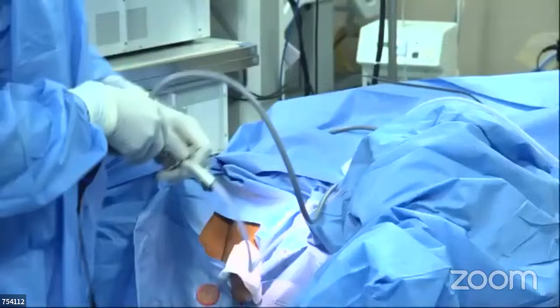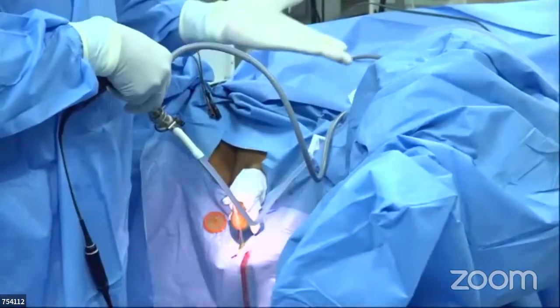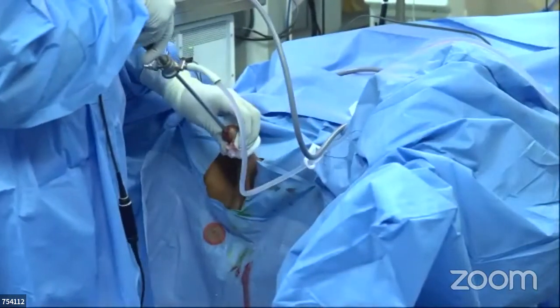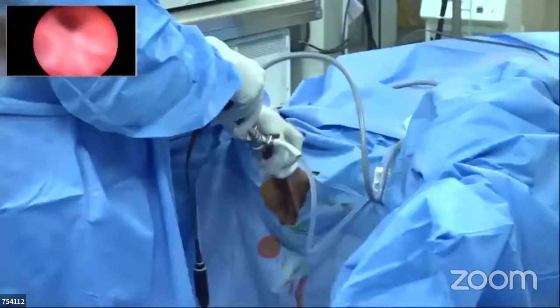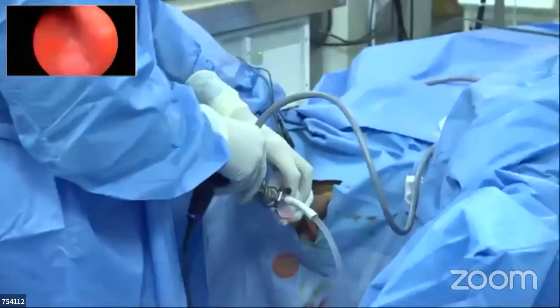Sir, we have slender resectoscopes, but the disadvantage is that the size of the chips you take is smaller and the resection takes a longer time with the slender resectoscopes. Yes, definitely. So apart from the size of the instrument, I'm doing a cystoscopy.